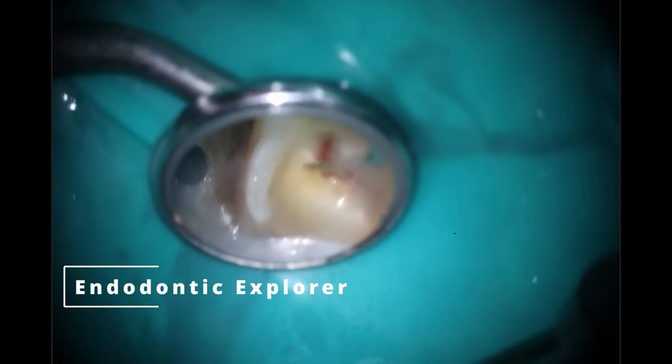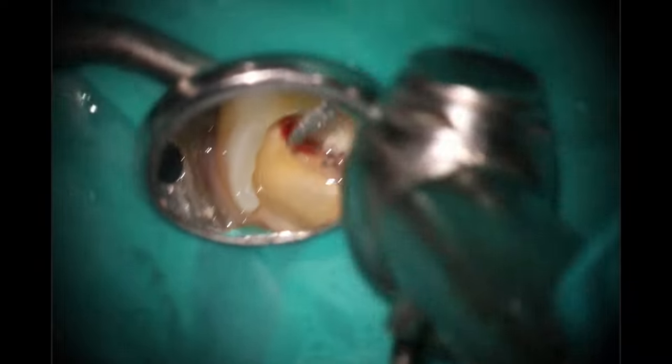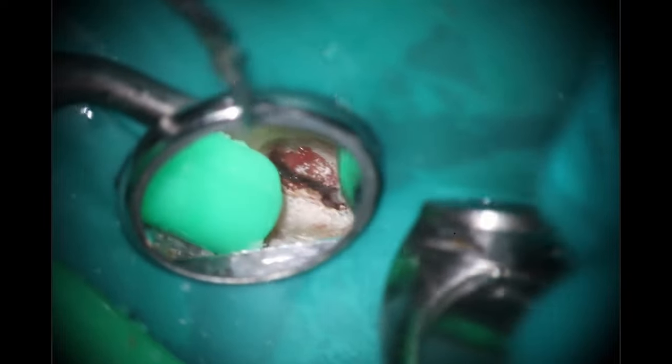Just checking it with the Endo Explorer. I know for vital pulp therapy this is a big no-no, but this tooth is no longer going to be vital in about 30 seconds. So I'm going to finish up my access here using that nice round tapered diamond. You can see the diamonds are actually stripped off the edge of this one — I didn't notice until it wasn't cutting. So I'm going to switch it out, and now with the brand new diamond bur it's actually doing its job.